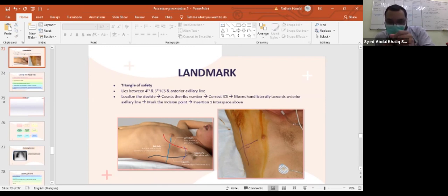So you puncture, you akan nampak ada gush of air, you removekan needle dia, tolak sikit dia punya plastik catheter tu in, lepas tu you masukkan guide wire. Guide wire masuk, you removekan catheter tu, lepas tu you dilate dan you masukkan chest drain. You letak pigtail for example. So actually Seldinger technique ni is very easy. So Seldinger ni is just you insert any catheter using a guide wire. That is Seldinger technique.